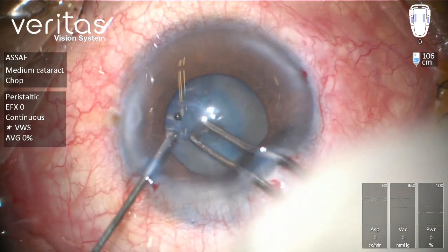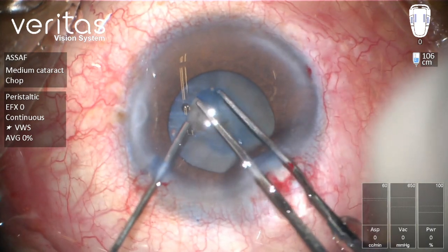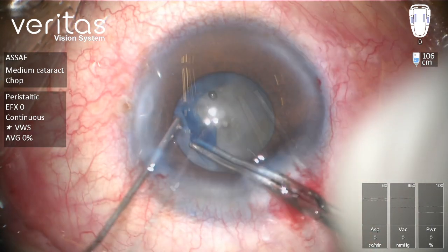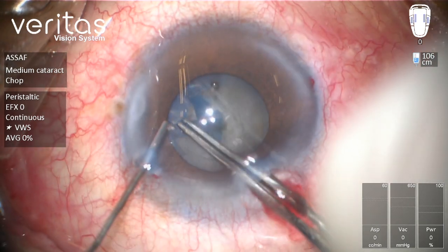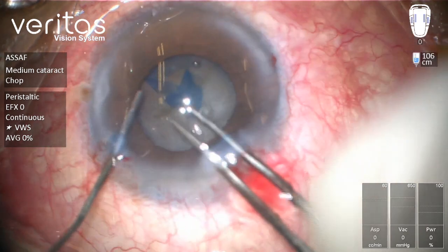This is a case of dense white cataract. As you can see, the pupil is not very well dilated, so this is a challenging case. The patient is single-eyed and the cornea has some opacity, so I estimate this pupil is around 4.5 to 5 millimeters.